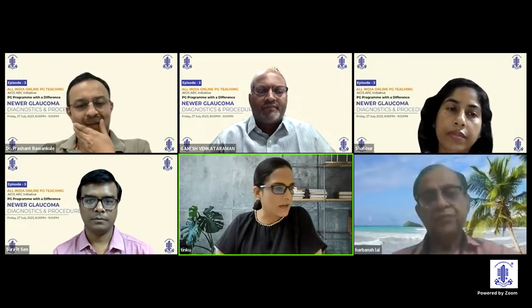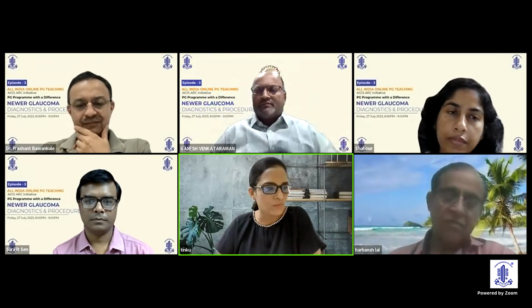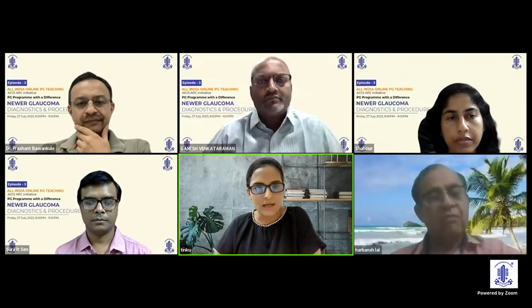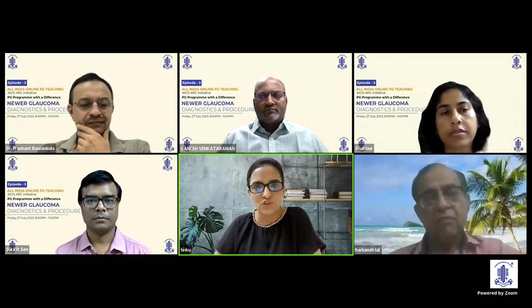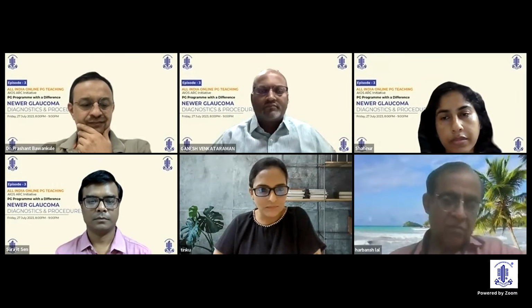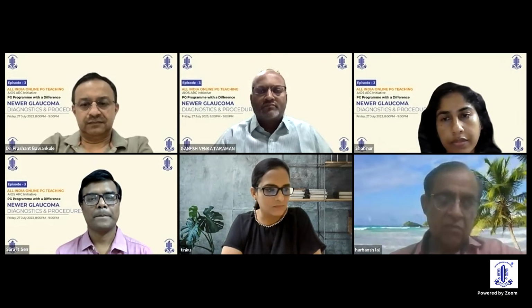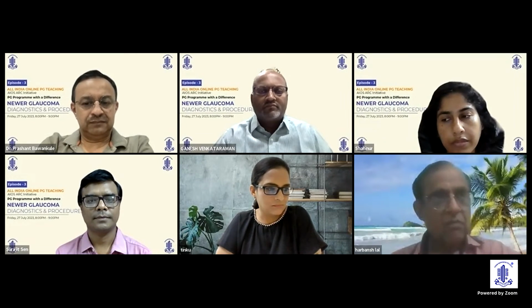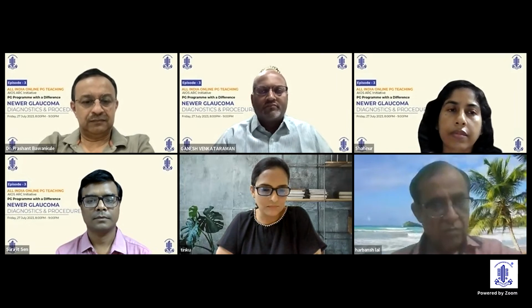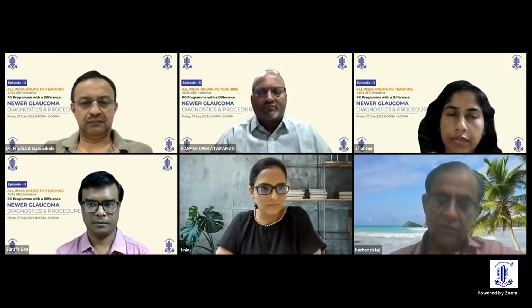Okay. The other question is to the panelists, Dr. Kalyani, if you could take that question. How accurate is the rebound tonometer as compared to the Goldmann applanation tonometer? As we know, it has different readings in the supine and sitting position. So what is the accuracy, and what is a good tonometer to be used in children? Yes, ma'am. The rebound tonometer is very easy to use and anesthetic drops are not needed. In supine position and children, it is very useful. But when you compare the accuracy, definitely the Goldmann tonometer, which is very near to the Perkins. So we prefer Perkins. But when it comes to the supine position and scarred corneas and such cases, we can use the rebound tonometer. Thank you.